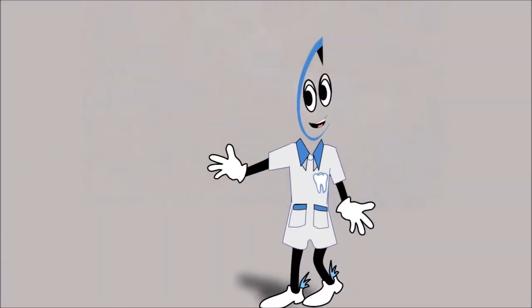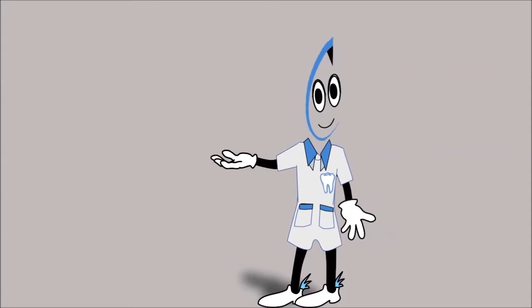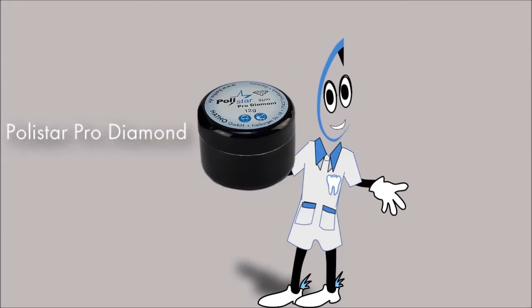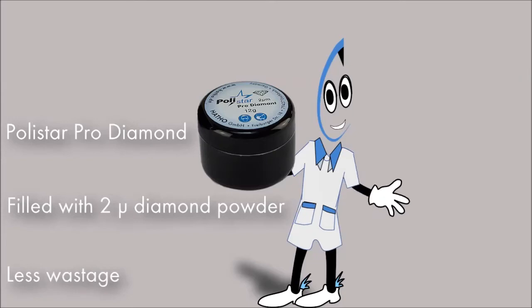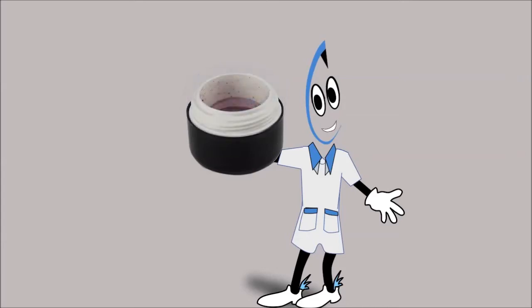Now I will present the new diamond polishing paste produced by Hato. This product is called Polystar Pro Diamond and is filled with 2 micron diamond powder. One does not need to use much paste to achieve a super high shine polish. We supply the Polystar Pro Diamond in oversized jars in order to ensure no spillage of the high quality paste.